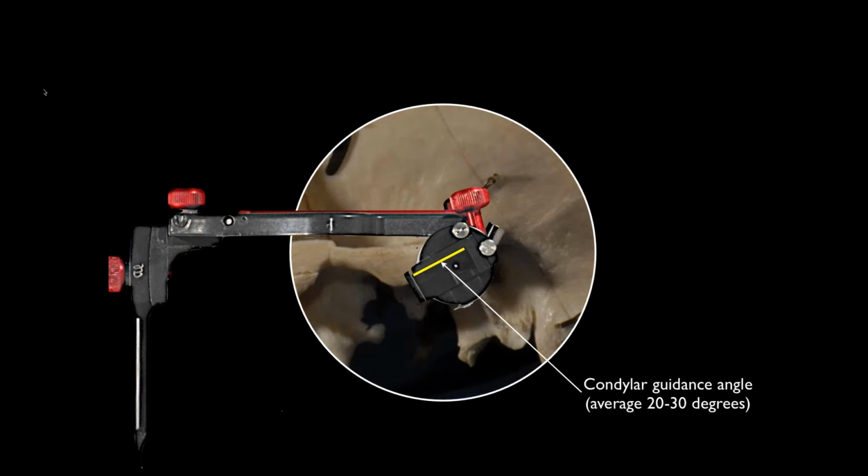And if we look at that, we ask ourselves, well, why do we do that? Why do we set a machine that's designed to be just like the human skull differently than what is normally there physiologically? That question we'll get to as we move through this presentation.